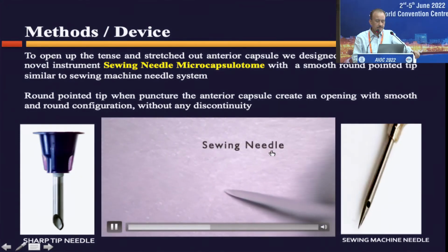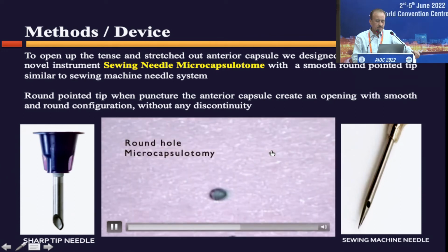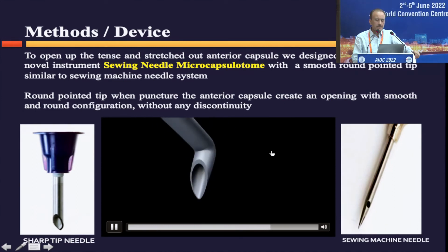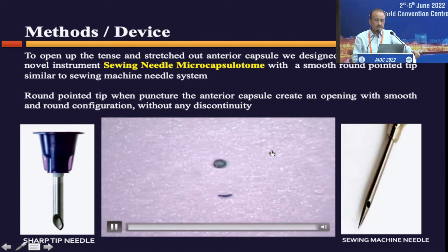This is a round and pointed tip. Now this round and pointed tip, when it pricks the anterior capsule, as I am showing here on the paper, will make a round hole on the anterior capsule. If you prick with this device, you will have a linear cut. So there is a difference, because this made a hole and this made a cut. The cut has a much lower resistance against the high pressure and the hole will have a much higher resistance.